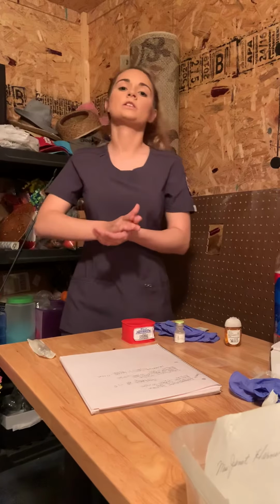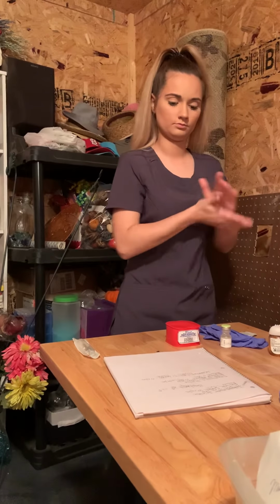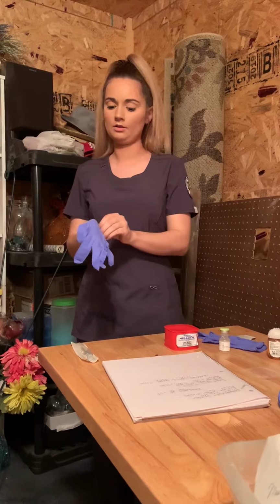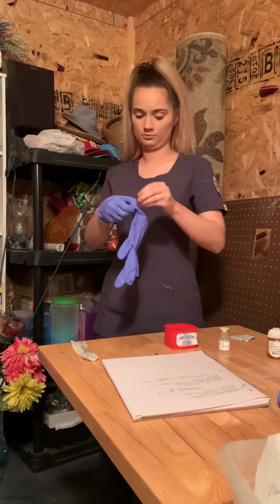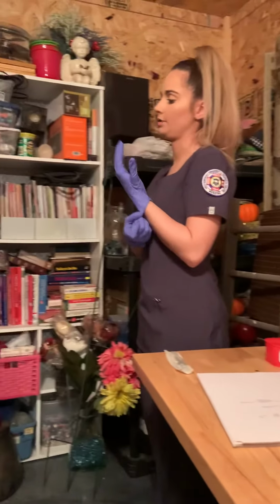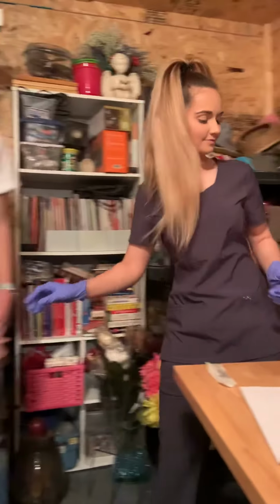For the subcutaneous, you will also want to knock on the patient's door, perform your hand hygiene. Don the appropriate PPE, which are just gloves for today. And you also want to identify your patient with your identifiers. Can you get your name and date of birth, please? Slade Cover, 11/1998. Thank you.